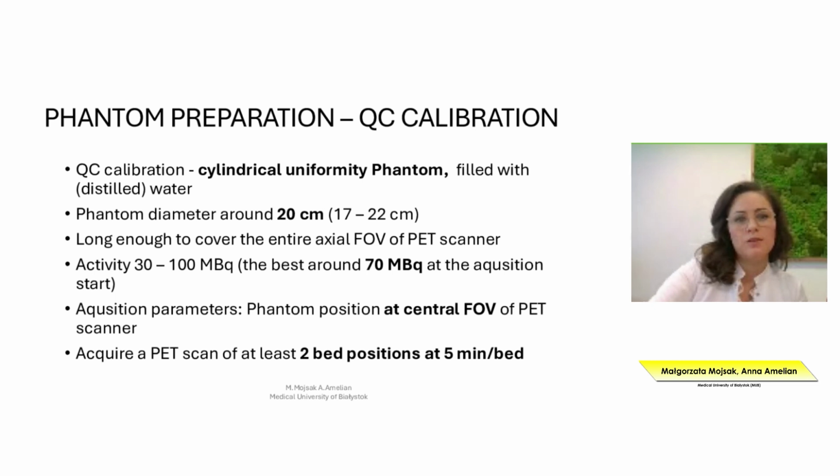We need to prepare the phantom for calibration. There is a special cylinder of 20 centimeter diameter, and we need to ensure 70 megabecquerel at the acquisition start.